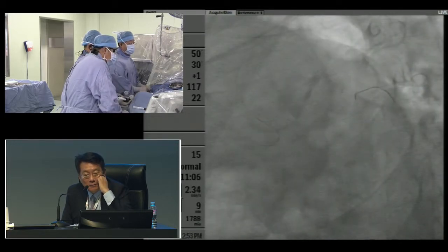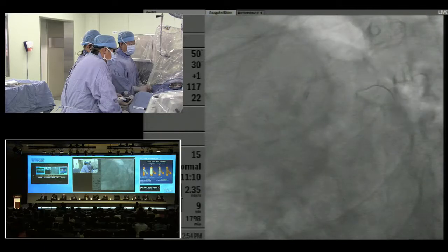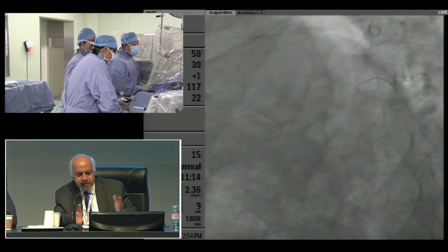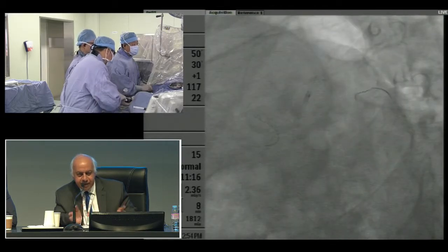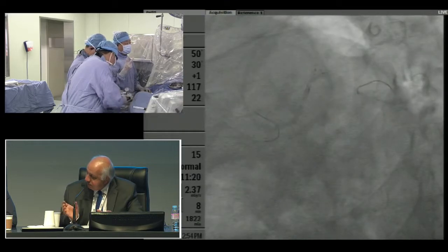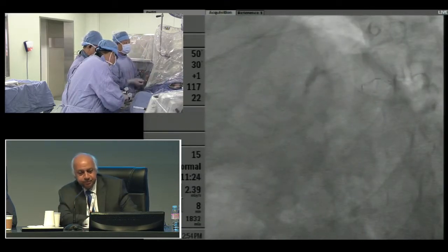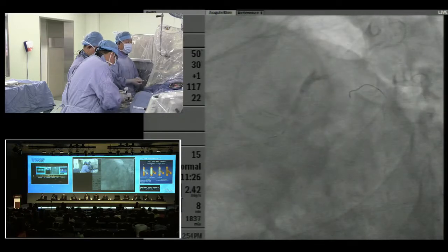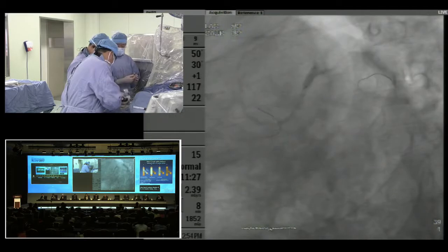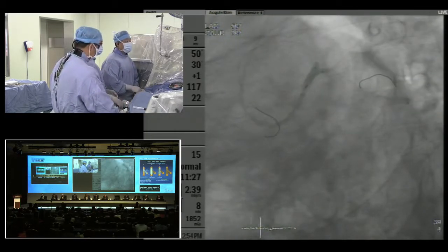Okay, great. But sometimes some operators do it differently, like the PCR group: 8 atmospheres for one, 16 for the other, then the reverse, and at the end you finish with two intermediate pressures. Are you doing the same? We do it this way. High pressure: 8, 10, 12. 12. Down. Okay, so the final kissing is finished.